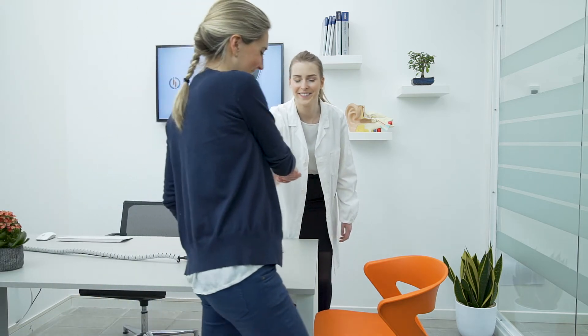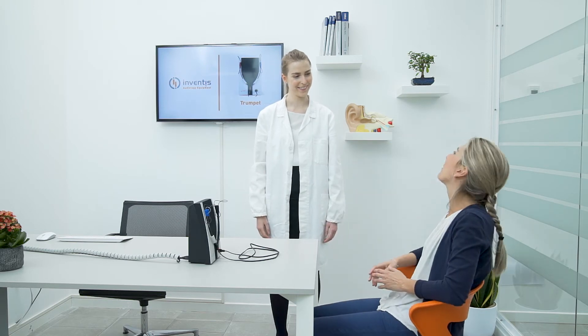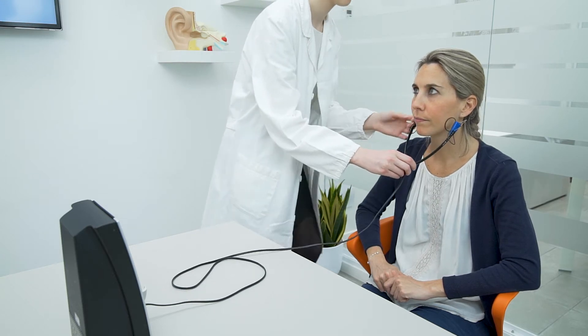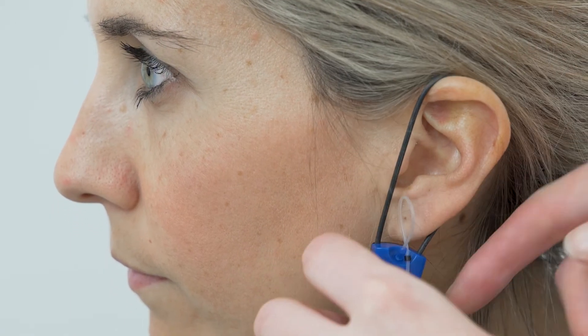Patient preparation is a crucial step during the fitting procedure and it is always helpful involving the patient in the process, letting them know what we are going to do. Once the headset is on, the position can be set according to the patient's comfort by simply adjusting the o-rings positioned on the ears.